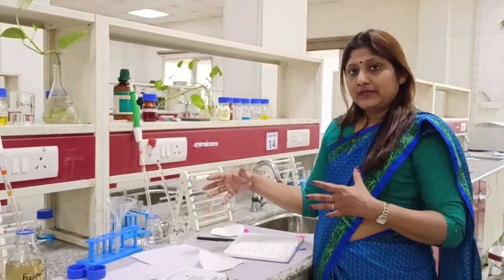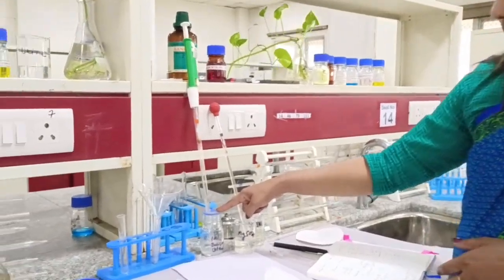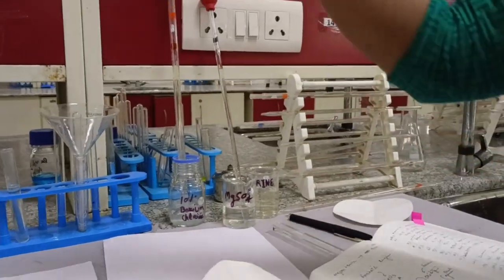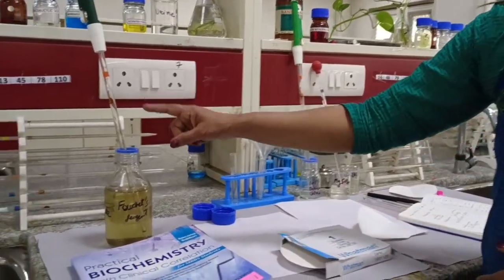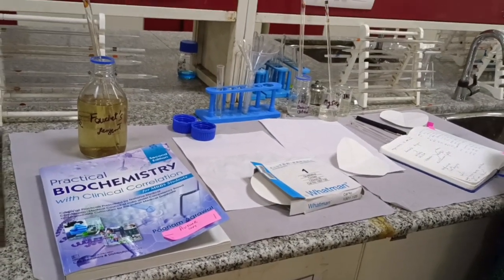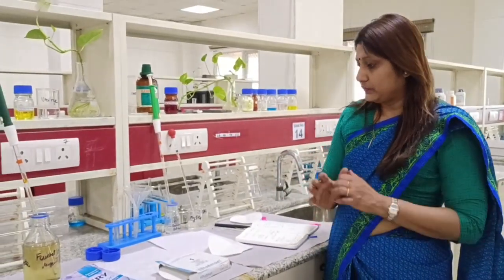First, let us see what reagents are needed for doing this test. We need 10% barium chloride, 1% magnesium sulfate, and the urine sample. You have to find out whether the urine has bilirubin or not. Most importantly, you have to use the Fouchet's reagent, which is freshly prepared using 10% ferric chloride and 25% trichloroacetic acid (TCA). TCA acts as a stabilizer and makes it soluble in the solution.